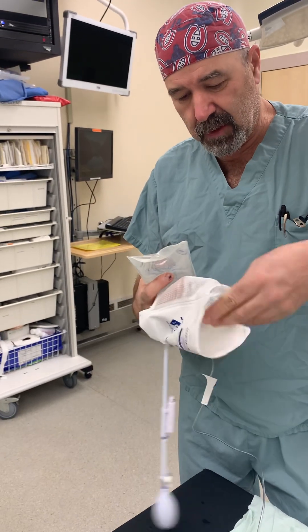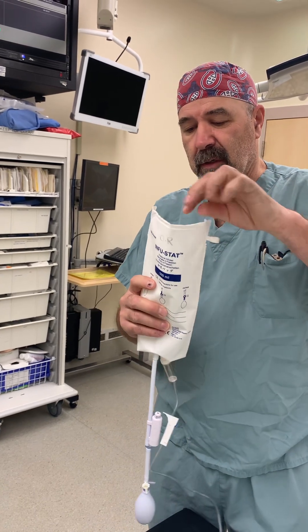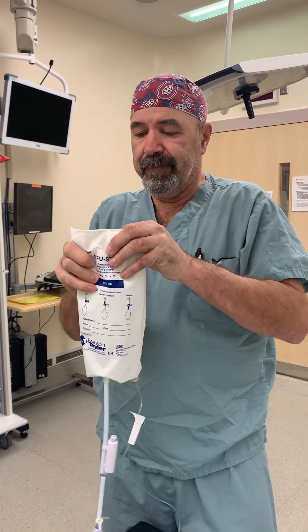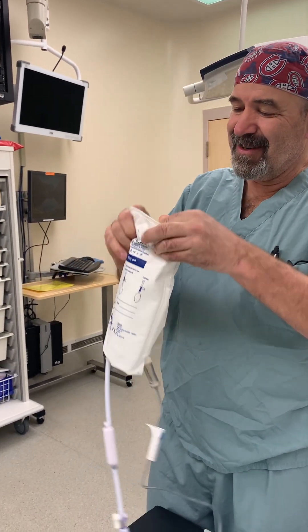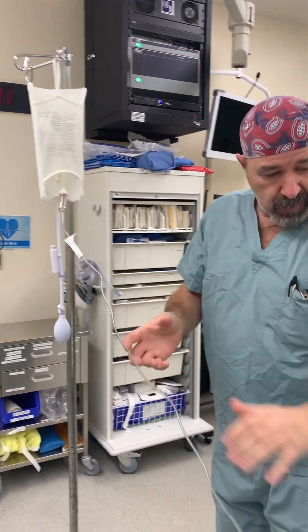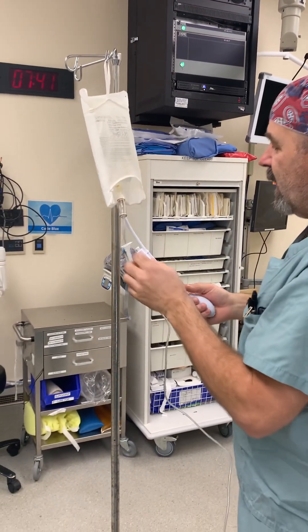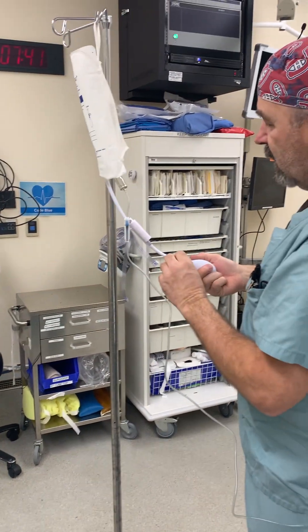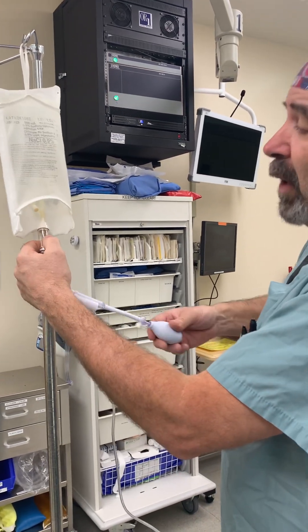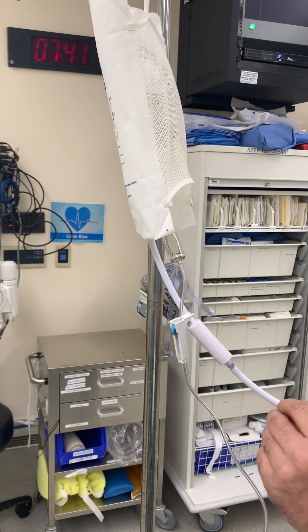The next thing we do is hook it up to a pressure bag. Because if this is not pressurized — and arterial pressure is higher than venous pressure — it will backflow and clog the line. Hang it on an IV pole. We're going to start pressurizing the bag. If you have no fluid here, or if you fill manually without priming, when you pressurize the bag it's going to fill this up too much and you won't be able to tell.